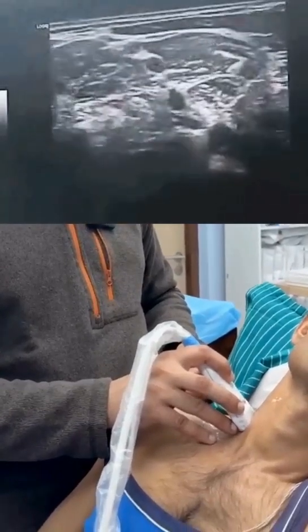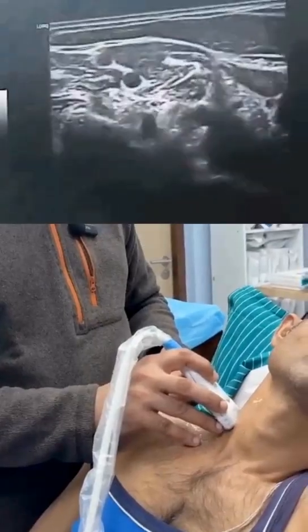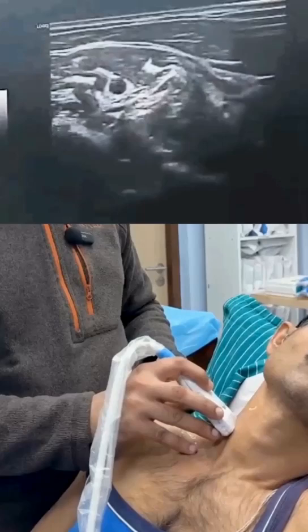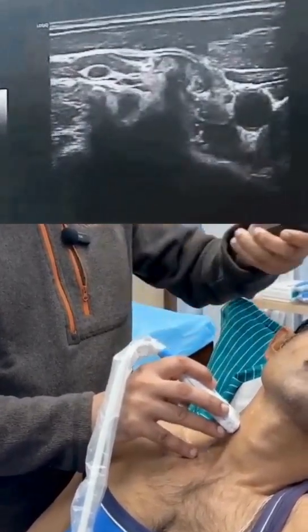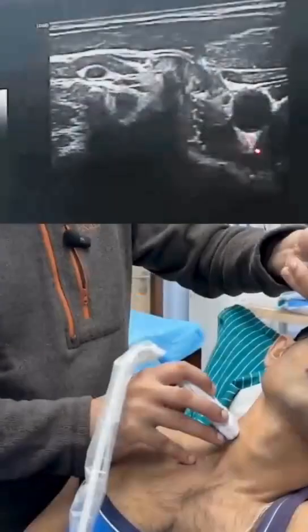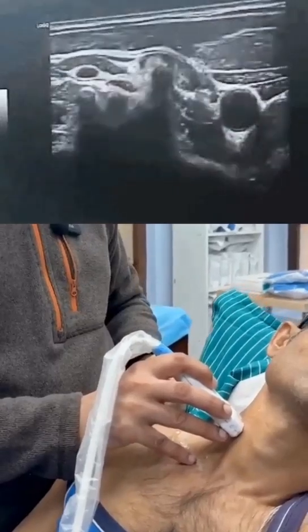As I go up, the C7 nerve root will dive into that area, and this is a typical beach chair appearance with the C7 nerve root disappearing. Going up further, I can now see the C6 vertebra with the anterior and the posterior tubercle. The anterior tubercle is quite prominent, as we all know, and the C6 nerve root is diving in now.